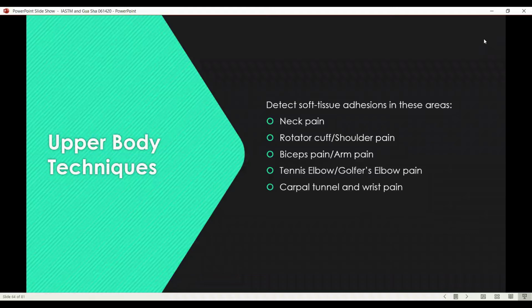Where and how would you use the strokes of sweeping, fanning, brushing, strumming, framing, and the J stroke?